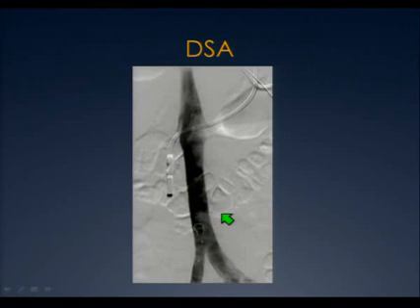After I put the filter in and I want to confirm that the filter is staying put and the filter isn't tilted, if an IVC filter, which is roughly shaped like a cone, tilts, 2 things happen. The IVC filter doesn't work as well, so clots could get by it, and the tip of the cone, which often has a hook or some device on the top, a hook usually, sometimes just a little nubbin, the hook will embed in the cava wall and you won't be able to take it out. So if it's tilted, I probably will put it back in and see if I can get it straight.